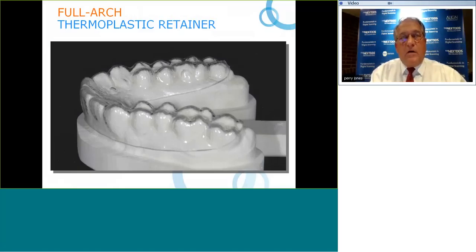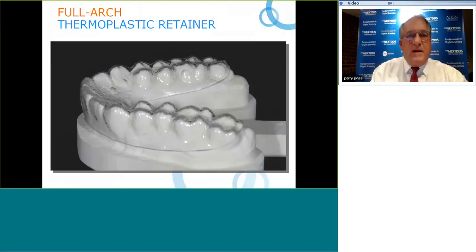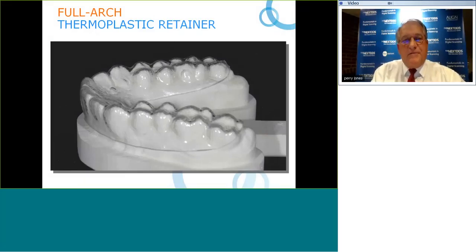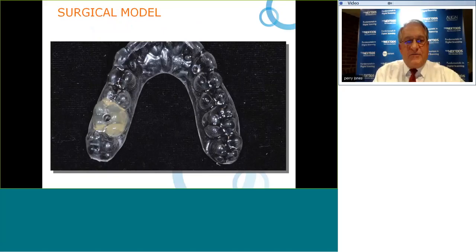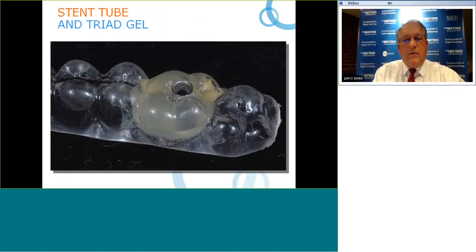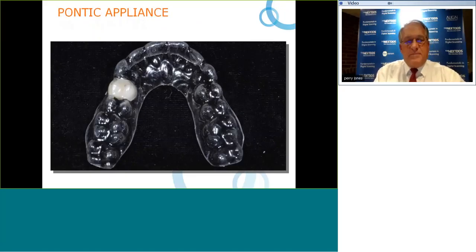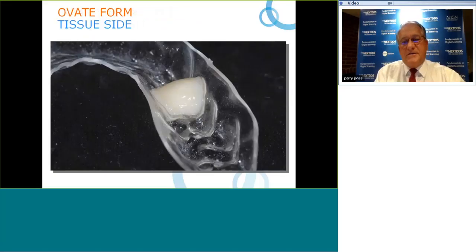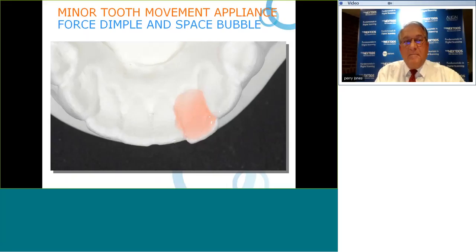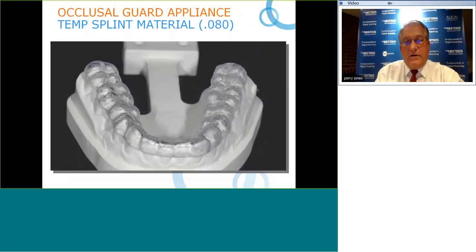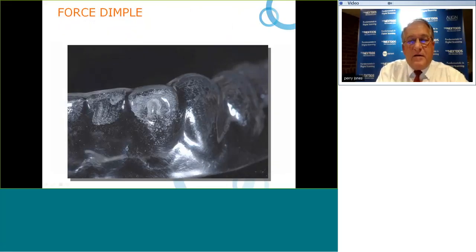Let's look at examples: a canine-to-canine retainer for settling the occlusion after orthodontic treatment; a prosthetic surgical guide with a stent tube to determine implant entry position; a pontic appliance — thermoplastic with a composite resin tooth — showing a nice ovate pontic for tissue formation; a movement or space bubble appliance with a force dimple on the labial surface that pushes the tooth into its correct position with proximal reduction on either side — useful for relapse cases.